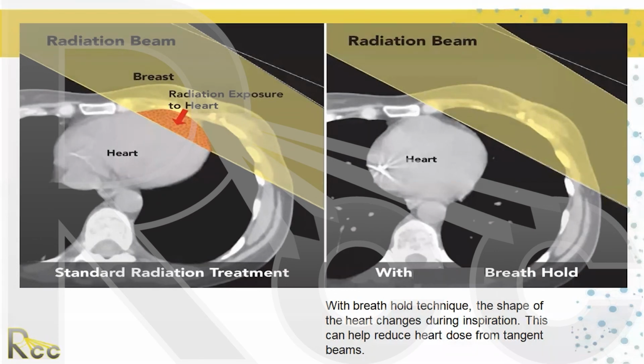So it's very, very difficult to say for sure what the dose is with portal imaging. But if the portal imaging is modern, it's good, it's sensitive, my opinion, don't worry about the dose. It's minimal.